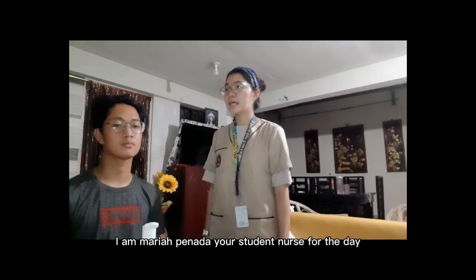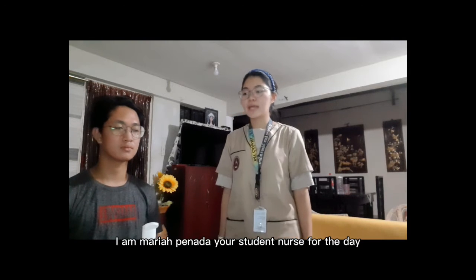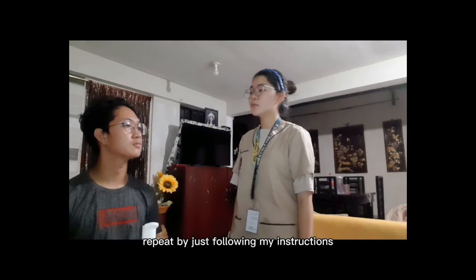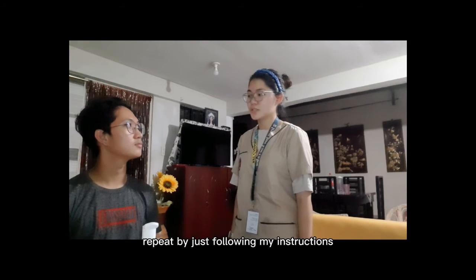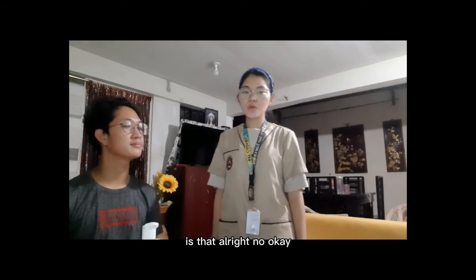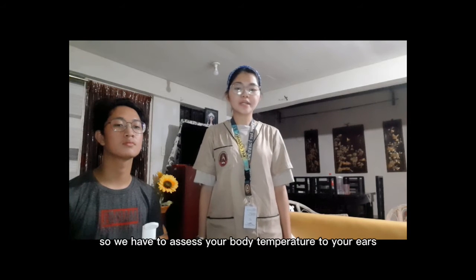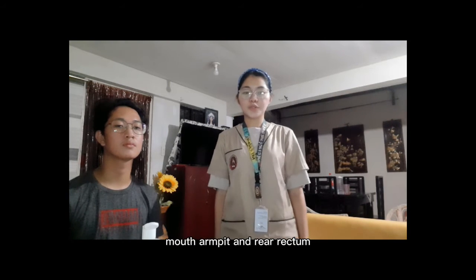So, sir, I am Mariah Pineda, your student nurse for today. And I'm going to assess your body temperature, and you may cooperate with me by just following my instructions. Is that alright? Yes, ma'am. Okay. So we have to assess your body temperature through your ears, mouth, armpit, and through your rectum.